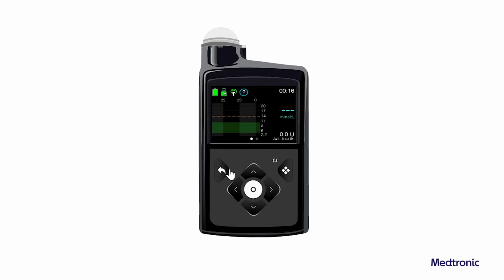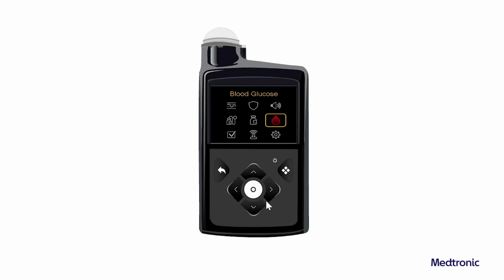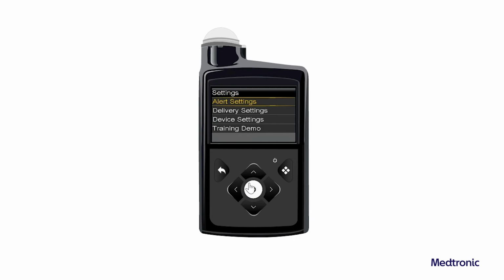High Snooze. The high snooze feature sets the amount of time before a high alert repeats. The pump shows the high alert again if the high alert condition still exists after the specified snooze time. To set the high snooze, from the home screen, press Select and then select Settings.